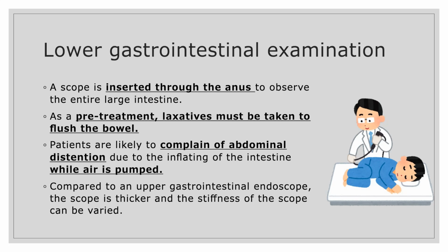Next is the lower gastrointestinal tract examination. A scope is inserted through the anus to observe the entire large intestine. While the upper gastrointestinal tract examination can basically be performed with fasting from the night before, the lower gastrointestinal tract examination requires the use of a laxative. Depending on the drug, approximately 2 liters of laxative is taken to flush the bowel.